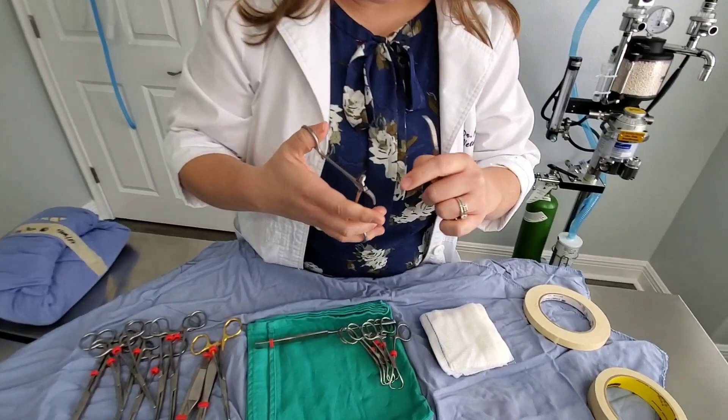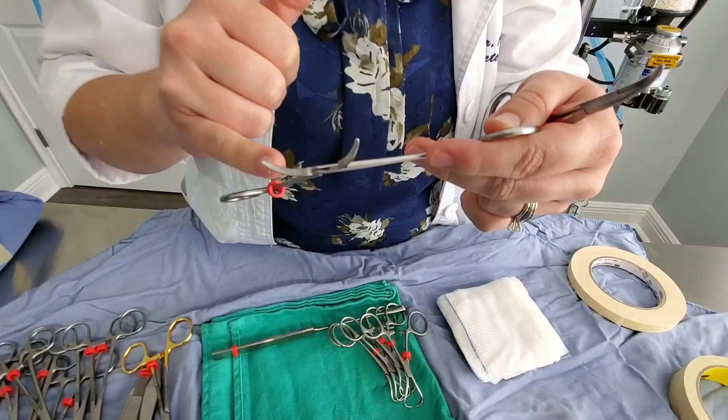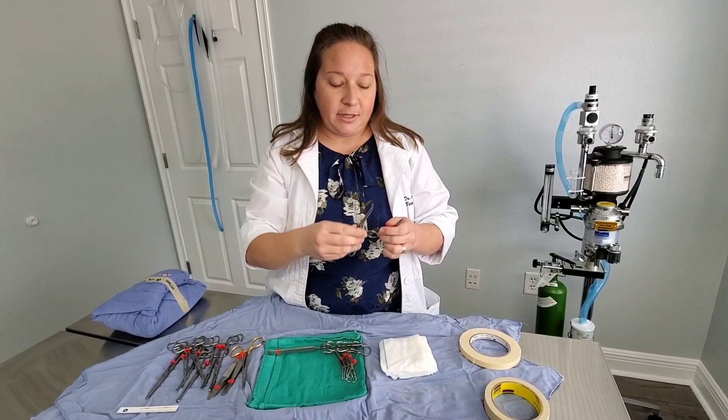These are my mosquito hemostats. These have another kind of groove — similar to the Kellys, but instead of stopping halfway, the grooves go all the way down to the base of the instrument. These are called mosquito hemostats and are great for clamping little arteries and small tissues, just handling what you need.